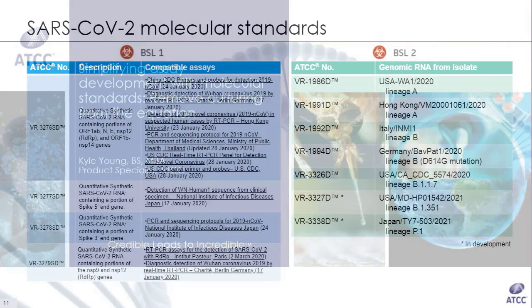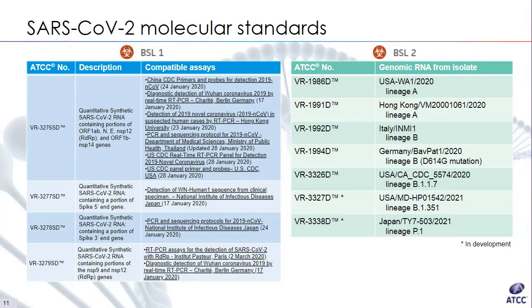One particular pathogen that's on most people's radar is severe acute respiratory syndrome-related coronavirus 2, and that's where I'll focus the assay design exercise. I'll start with some explanation of the catalog numbers we're looking at here. Starting with the list of synthetics on the left.